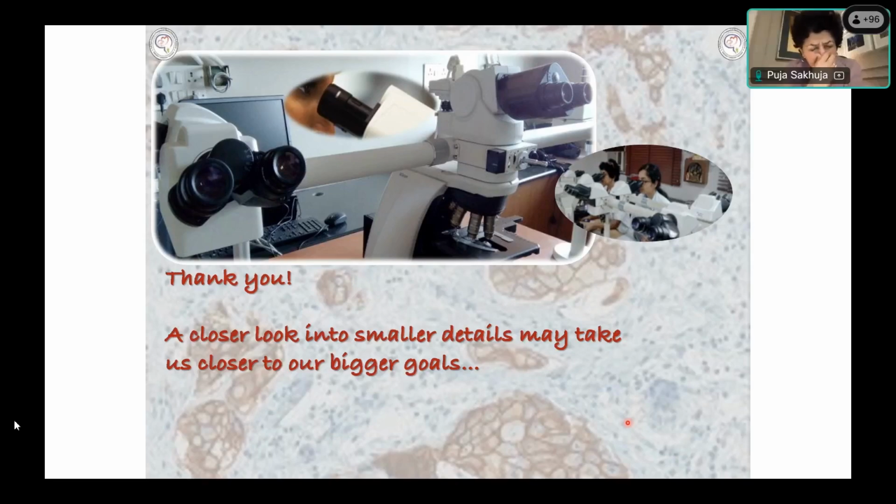Question is, if you've got a duodenal peptic ulcer, you're talking about a biopsy either from the duodenum or from the stomach, right? If you're talking about a biopsy from the stomach, usually you must mention the degree of chronic gastritis, like the Sydney system. You must mention the degree of activity, pitting, erosion, ulcer, or just neutrophils in the lamina.